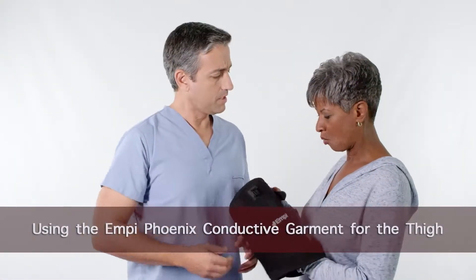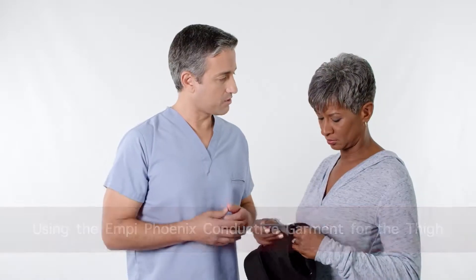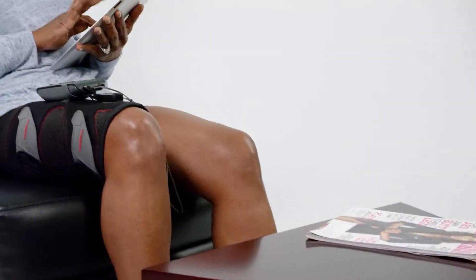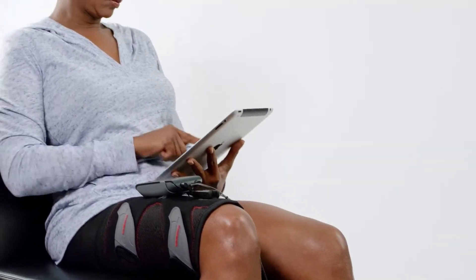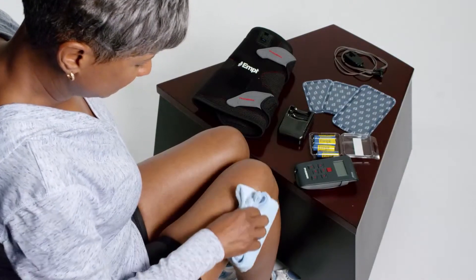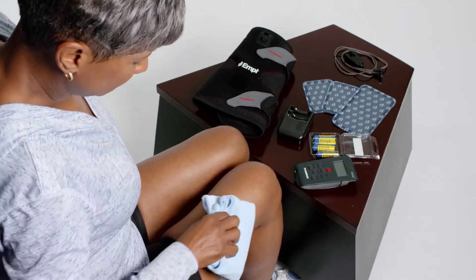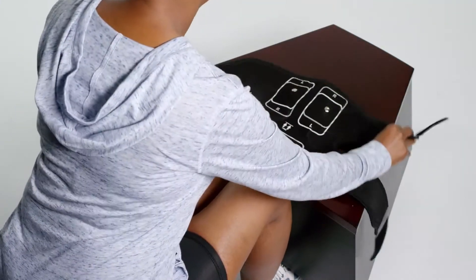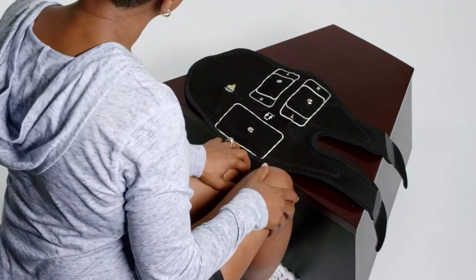Your doctor may have prescribed the MP Phoenix conductive garment for your thigh in addition to the MP Phoenix device. This garment is intended to improve the ease of use in applying this therapy. To begin, wash and dry the skin on your thigh where you will place the garment.